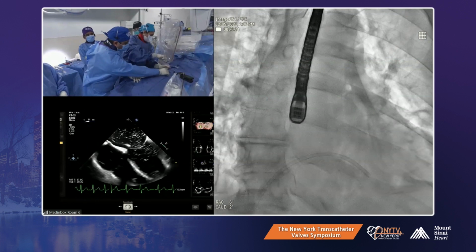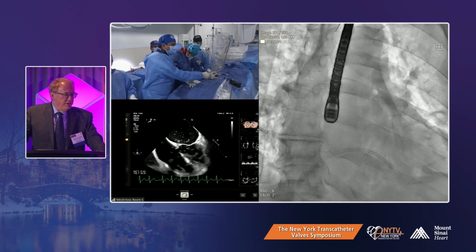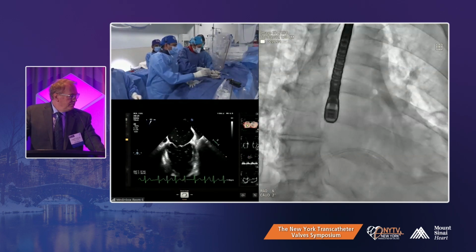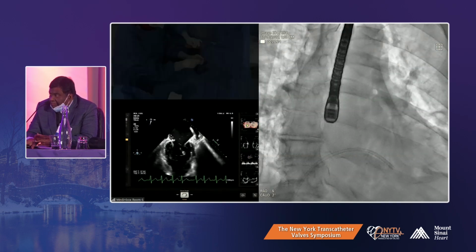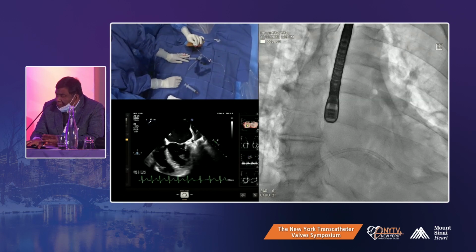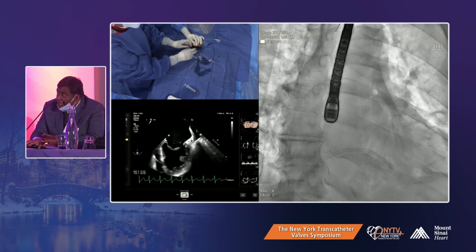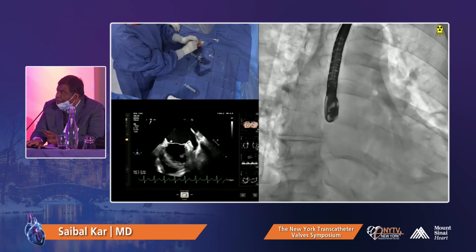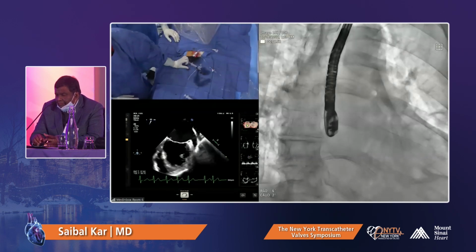There's a lot of discussion about whether you can use the acute response in the left atrial waveform as a prognostic predictor, and that's one thing we did not look at in COAPT. I routinely do that in all cases. I actually have a double wire and one 4 French pigtail without the guide. And to me, if there's no change in LA pressure or an increase in LA pressure, that's usually a bad sign. Right. So an acute reduction or a change in the V wave, one of the two, at least the V wave.